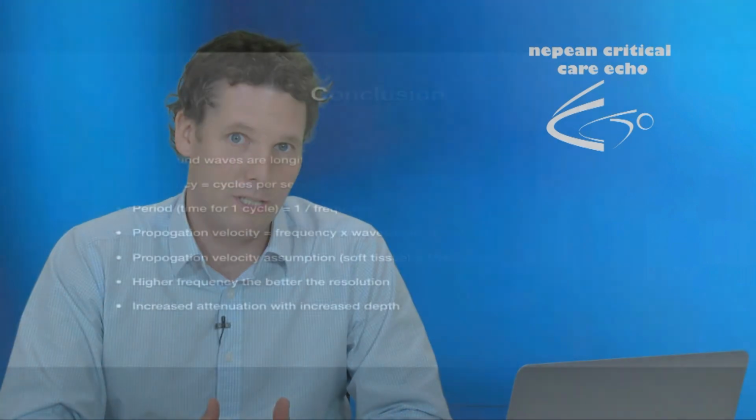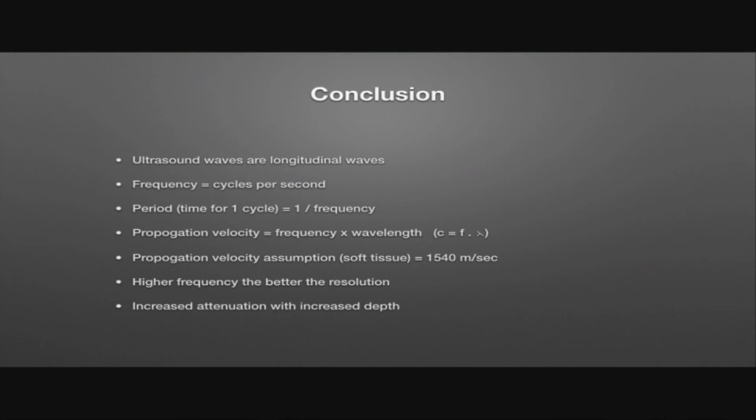So in conclusion, we can say that ultrasound waves are longitudinal waves, which are compression waves moving parallel to the direction of travel. Sound waves are measured in number of cycles per second, or ones of compression and rarefaction. And we're typically measuring those in megahertz, and they're somewhere in the region of 2 to 15 megahertz in diagnostic ultrasound frequencies.